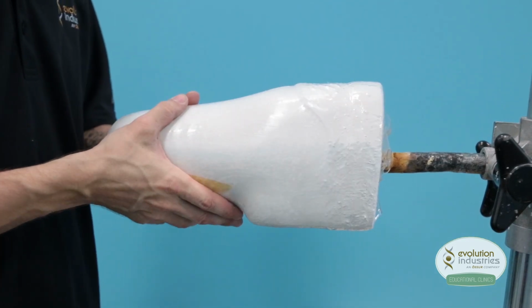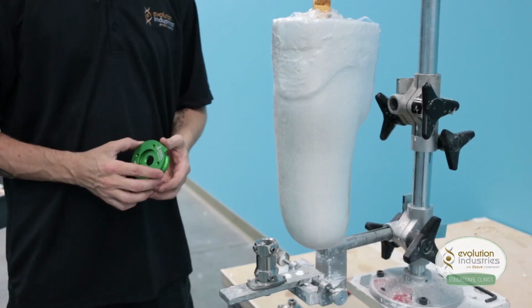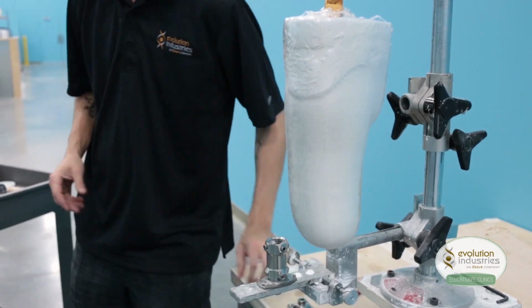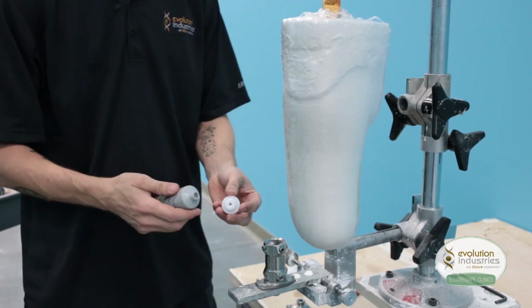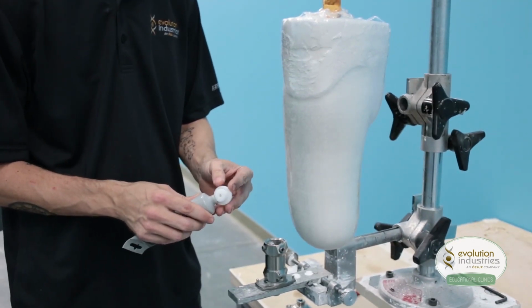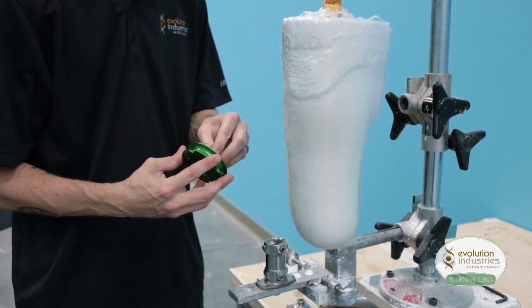And now we can put it back into the jig, and we will Evo bond our VMP 007 valve plate. Now we are ready to prep our VMP 007 valve plate. And to do that, we get our valve lamination dummy, some of our synthetic grease, and we lubricate the threads. And you want to use synthetic grease as opposed to petroleum jelly or Vaseline, because those items can actually act as a wick for your resin or Evo bond.